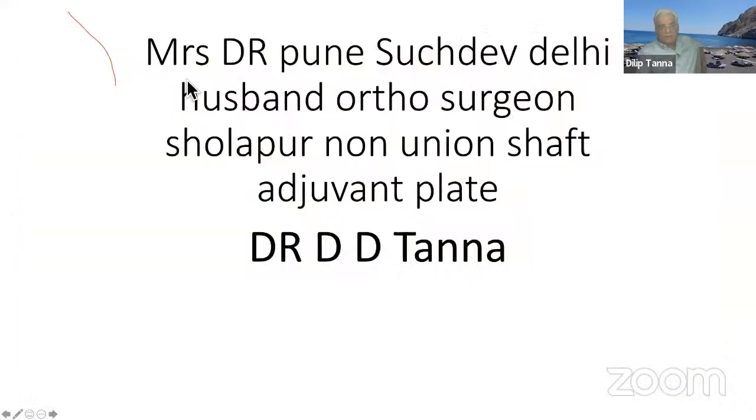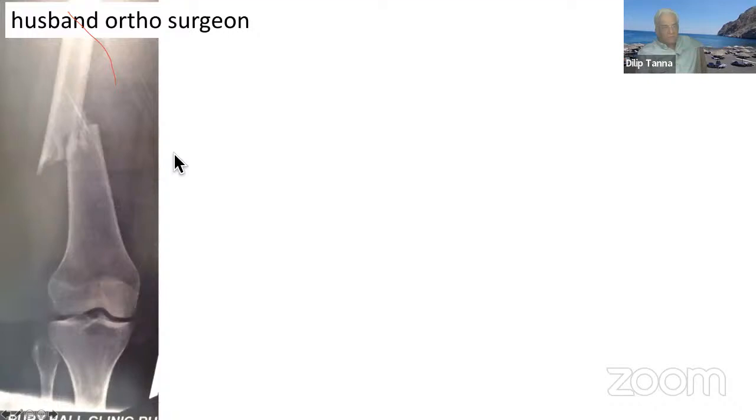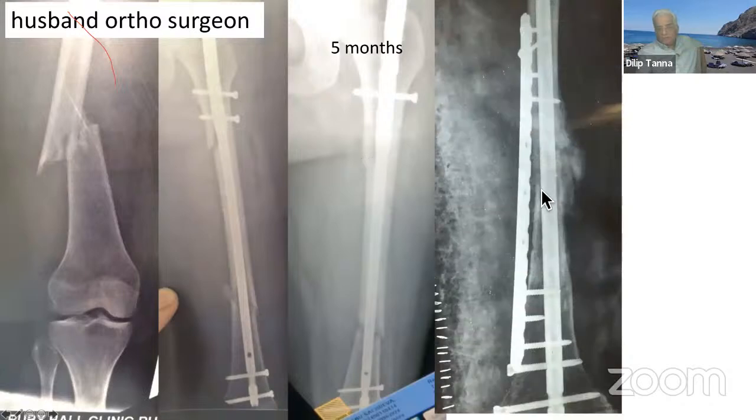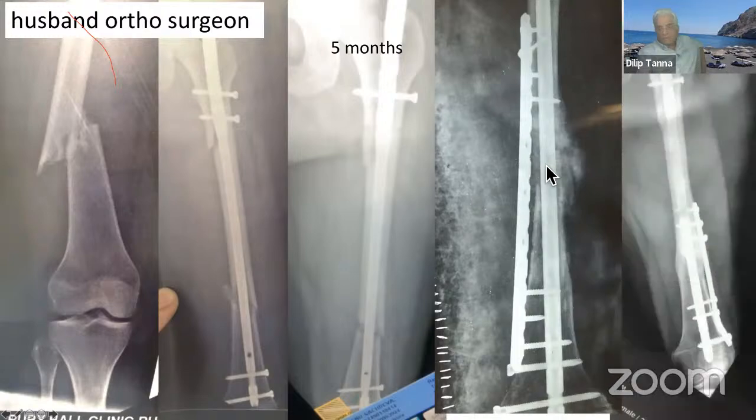Now this was also Dr. Sajdev from Delhi, husband of an orthopedic surgeon, again a fracture, again the same thing, an antegrade nail. This was a segmental fracture, so it's perfectly all right. But this could have been supplemented with a plate primarily. This ended up with the proximal fragment healing up, but the distal fragment didn't heal up. So ultimately we had to do this, and then the fracture healed up.